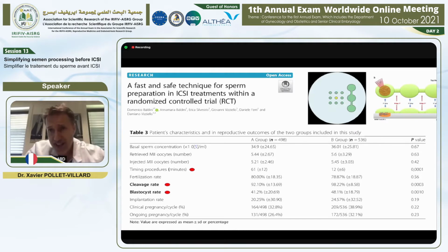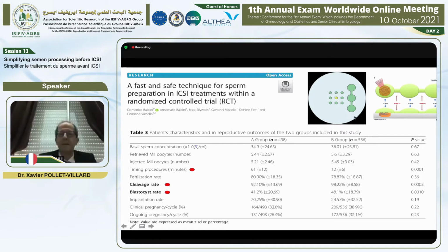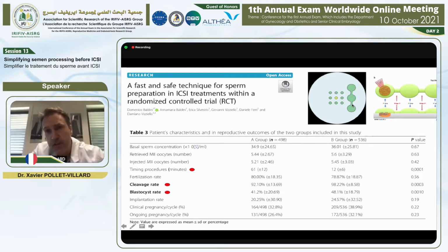So how can we simplify things from now, because we know that centrifugation may be detrimental to the spermatozoa? Well, there is a very nice RCT from an Italian team, which is quite recent, that shows that you can do a horizontal swim up directly in the ICSI dish. So you just have to put 50 microliter drops of sperm media here. You put the raw semen here, and you just let the motile spermatozoa migrate through the drops, and you harvest the spermatozoa here, and you inject. Well, this RCT showed that when you did that, you had an improvement in cleavage rate and blastocyst rate. Implantation rates were not improved, nor clinical pregnancy rates.